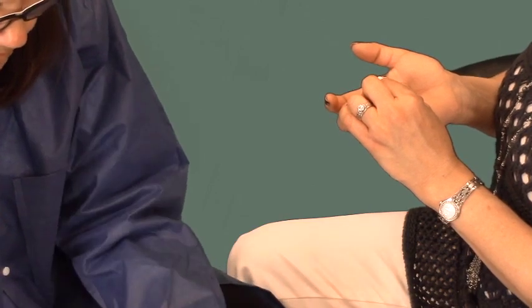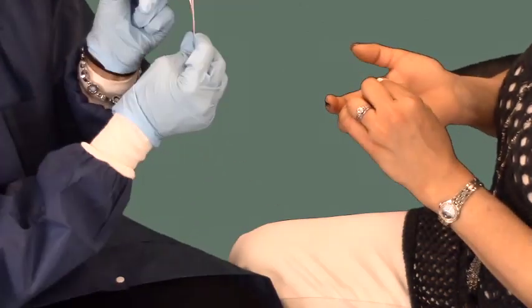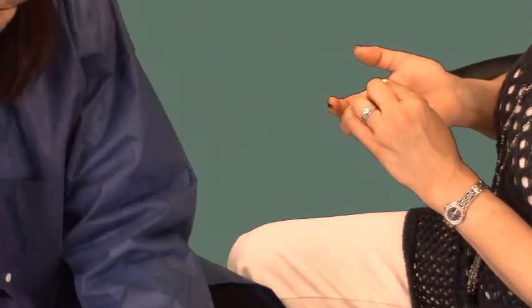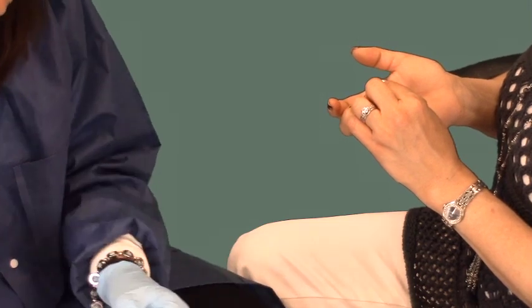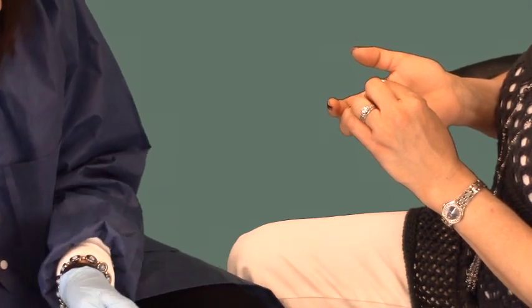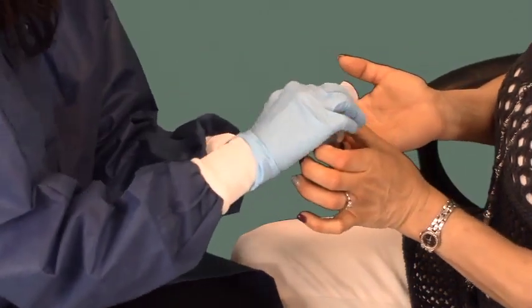Label the card with the patient's name and date of collection. Show the card to the patient, parent, or guardian to be sure it's labeled correctly. Cards must be allowed to dry for a minimum of four hours before being placed in the zipper baggies for shipment to the Indiana State Department of Health laboratory for testing.